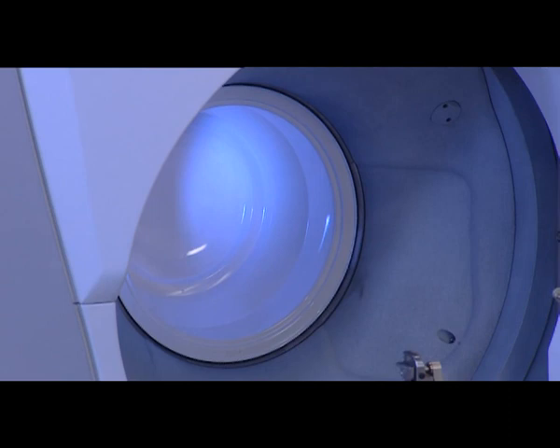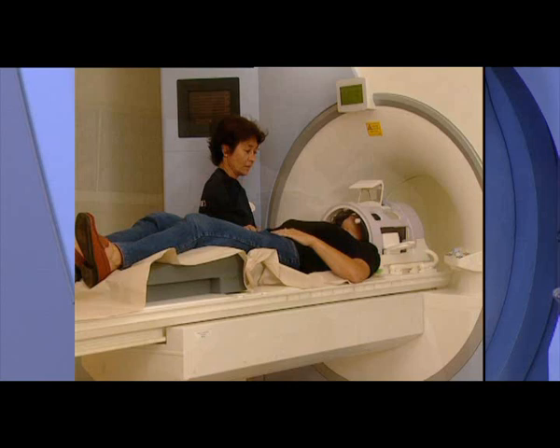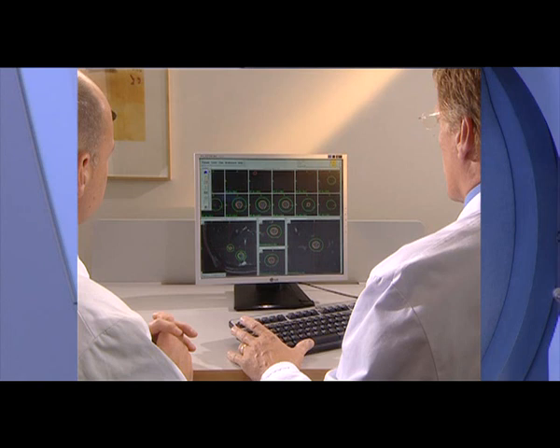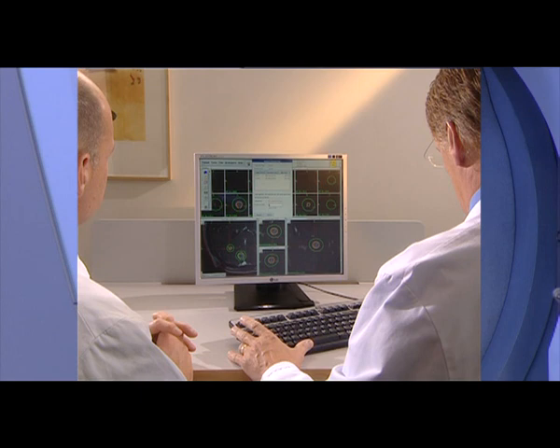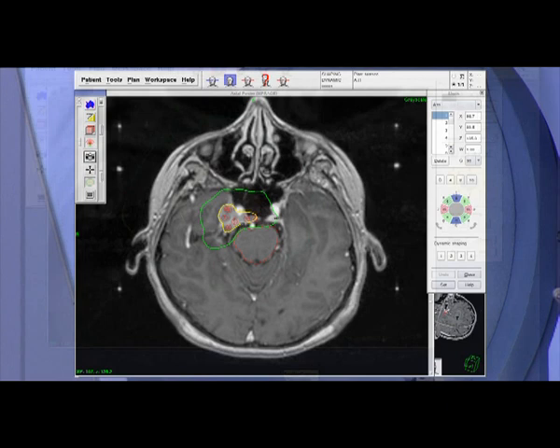There are four steps in a Gamma Knife surgical procedure. Surgery starts with attaching the Leksell coordinate frame, which immobilizes the patient's head throughout the entire procedure, during imaging as well as treatment. Once this is done, radiological imaging can begin and is followed by treatment planning with Leksell Gamma Plan PFX, an integrated system for the planning and implementation of stereotactic radiosurgery. Based on the coordinates provided by the stereotactic coordinate system, a number of isocenters to be irradiated will be defined to ensure accurate target coverage.